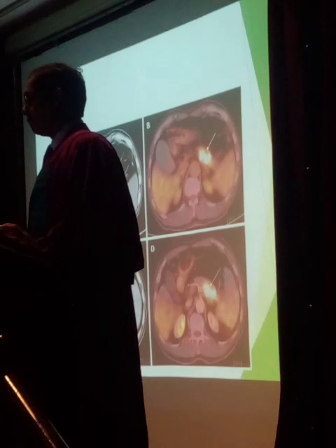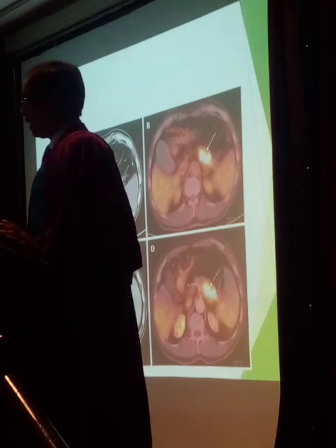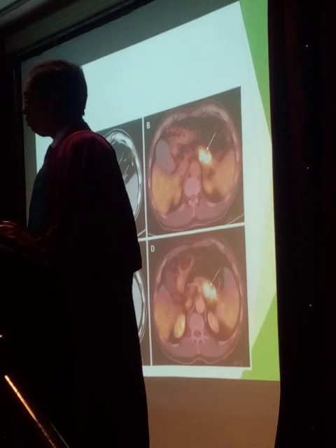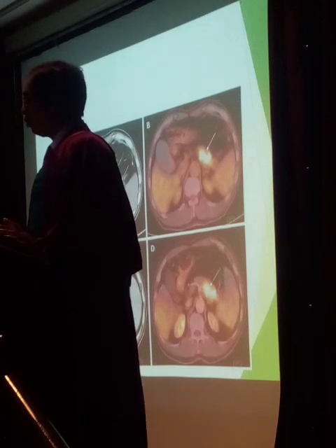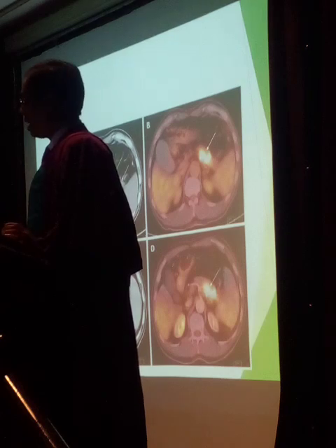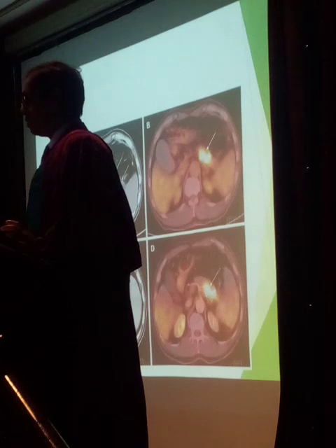So if we want to see the extension of the metastasis, we can do PET-CT, and we can do it for follow-up even. If you think it's early recurrence, it's better to do PET-CT than MRI or CT, because sometimes these post-surgical changes mix up and we can't exactly say whether it's early recurrence or not.